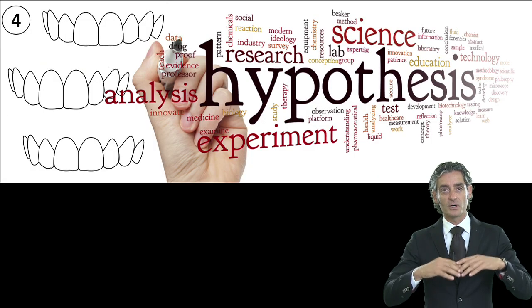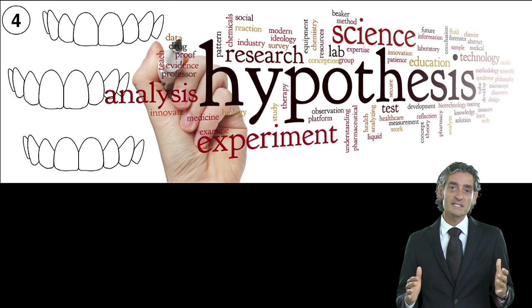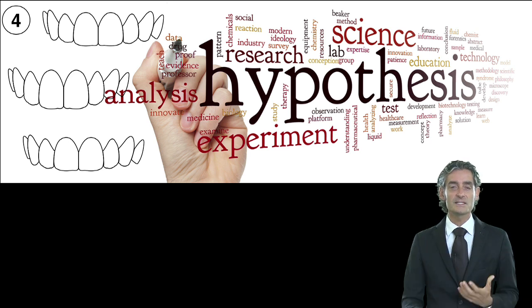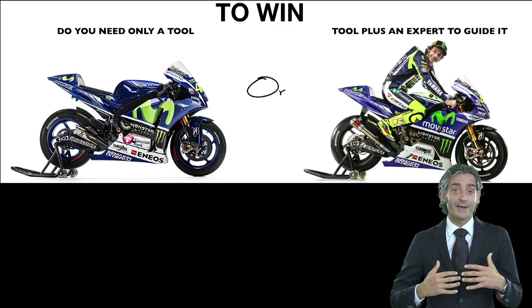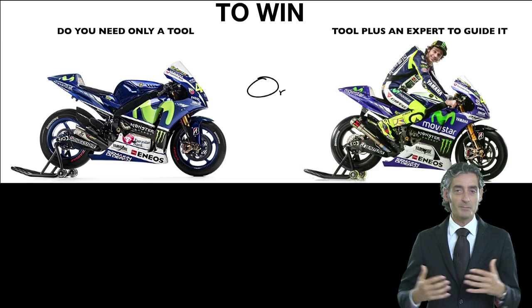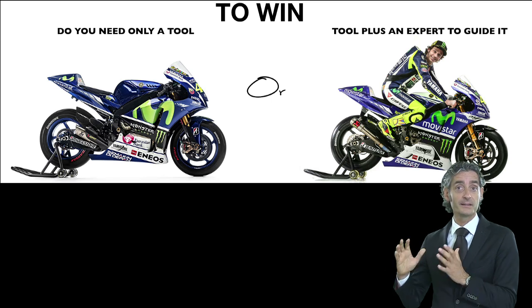And then after all this evaluation, we can jump into the fourth step, the fourth chapter. For us, hypothesis is the idea of aesthetic that we want to have for our patient, and then how we can give this hypothesis to our technician in order to make a work-up. First of all, we have to give an idea. And right now, we are really familiar with the digital smile design, because in the last period it became really famous. I think it's a really important tool, for some reasons, to communicate with the patient and communicate with the lab.